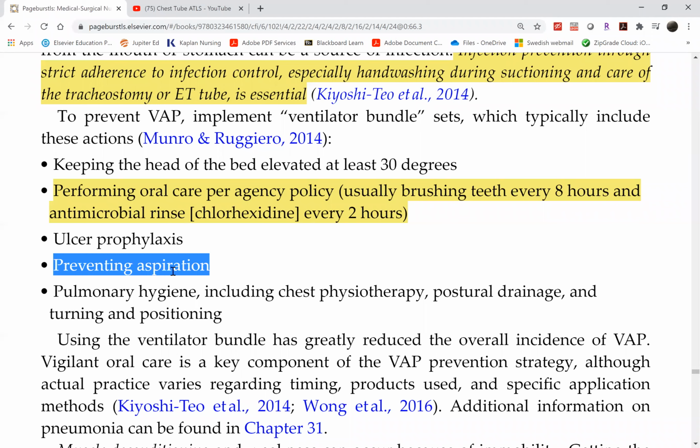We do have high-low evac tubes, but I don't know why they don't use them as a standard. Most ET tubes have 2 lumens, one for the balloon for the cuff, and one for the airway. A high-low evac tube has 3 lumens.